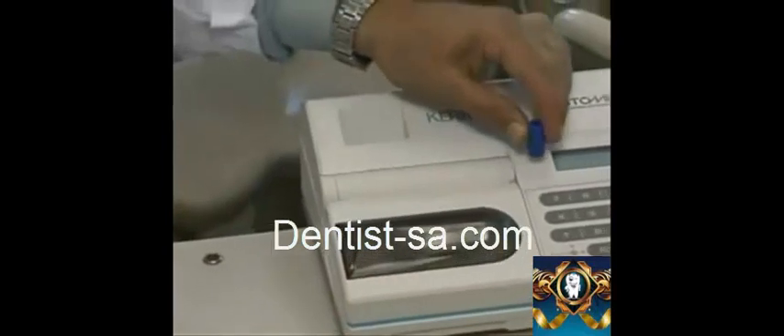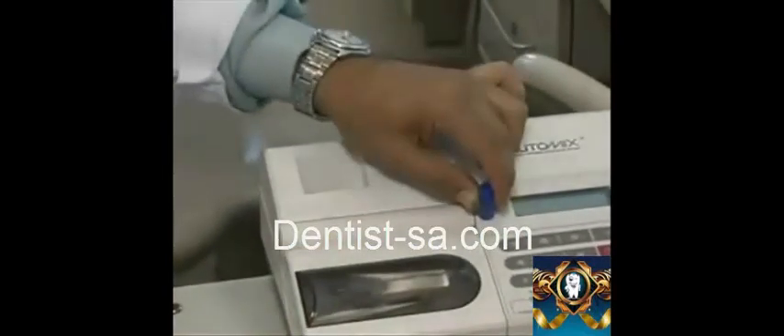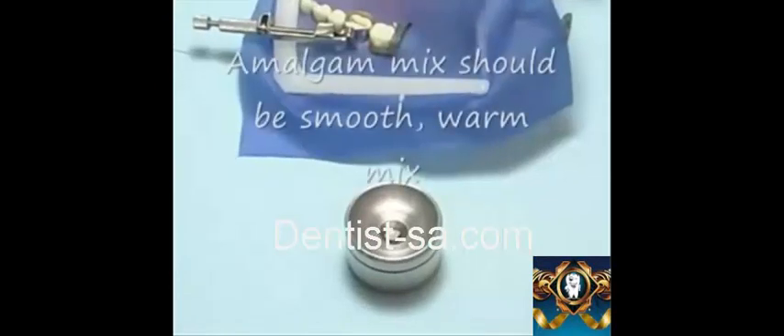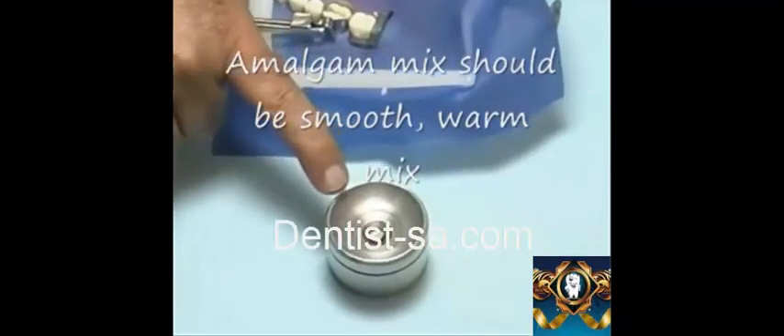Tap the amalgam capsule upside down against the benchtop and use the handle of the mirror to pry open the cap and empty the amalgam into the metal well. The amalgam should be spherical and shiny.